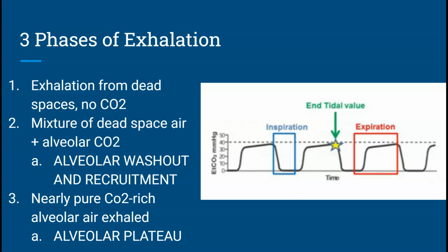So you have to understand that you're following the whole course of breathing, but what you're measuring is your expiration. You're measuring carbon dioxide. If you were to measure inspiratory, it would be the complete opposite of what you're seeing here. If you were measuring oxygen, it would be the same thing, except right here would be exhalation, inhalation, and then exhalation again.